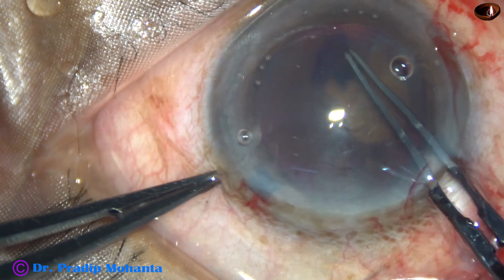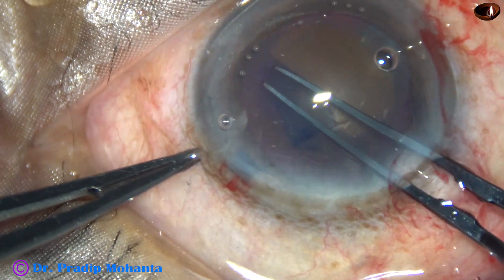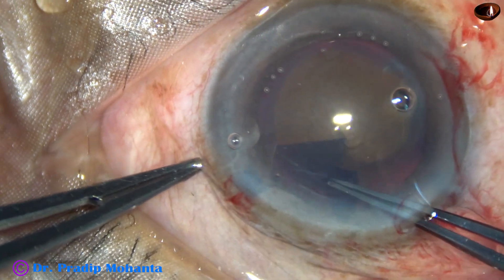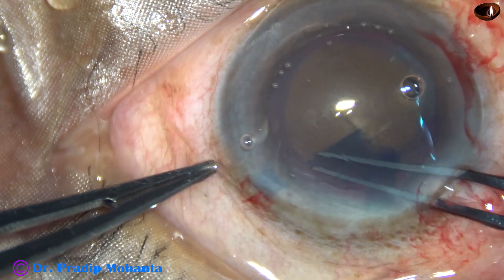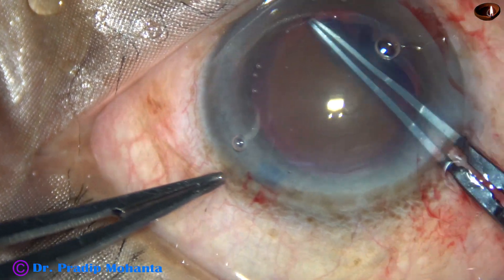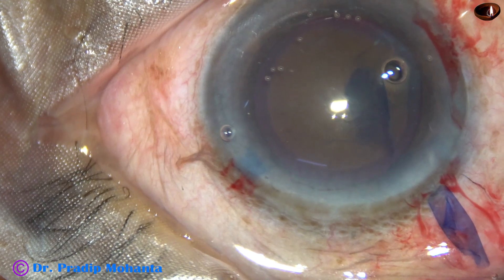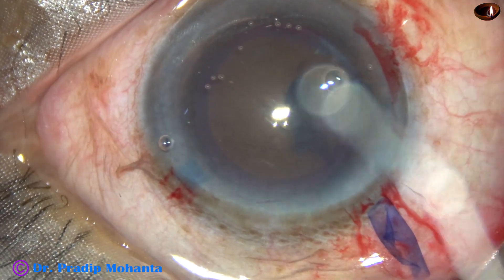The capsular tag is guided anti-clockwise. Since this is a hard nucleus, a large rhexis is performed. The size of this rhexis is about 6 mm.